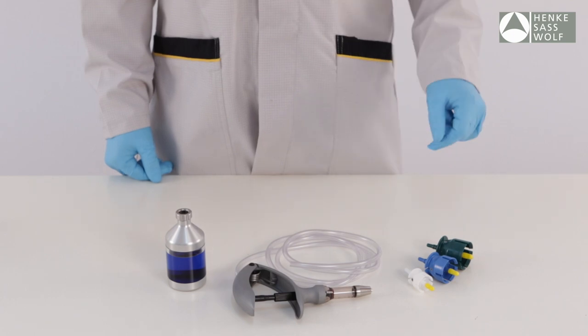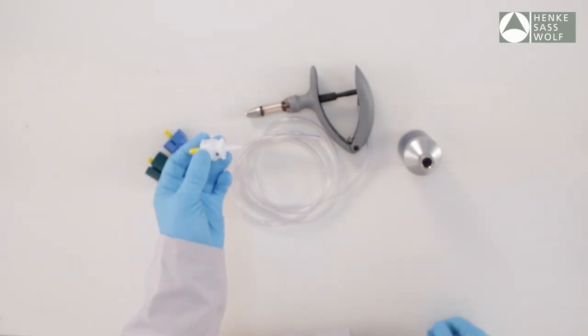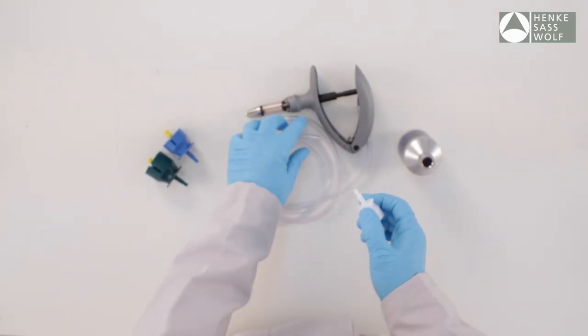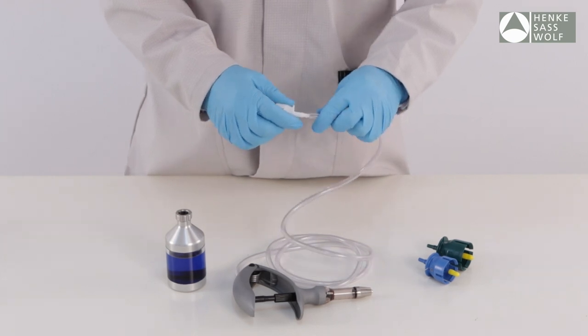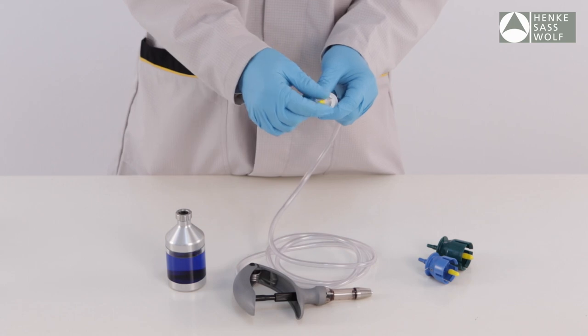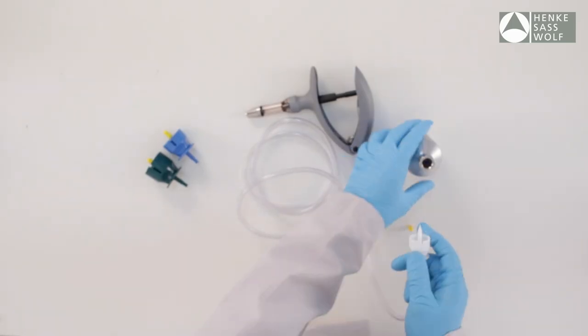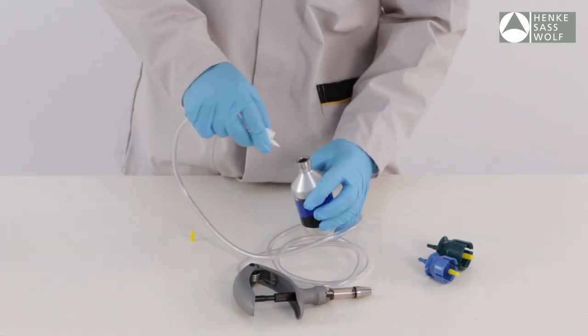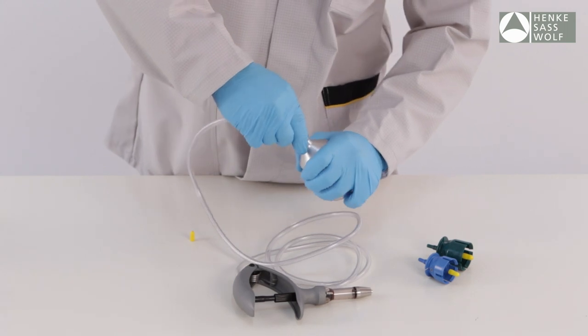Henke SAS Wolf syringes with tube attachment. Select the corresponding draw-off cap for your bottle you want to use. Attach the end of the tube to the draw-off cap. Take off the security cap and stick the spike of the draw-off cap into the center of the rubber cap of the bottle.